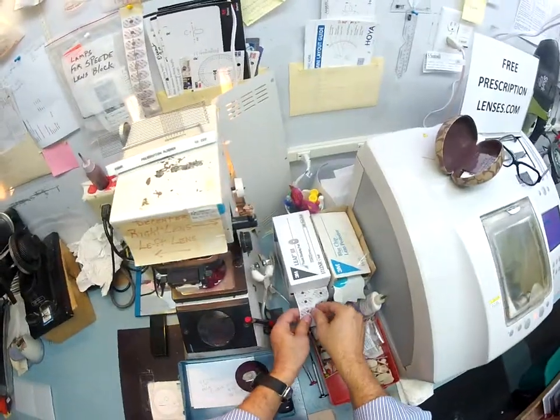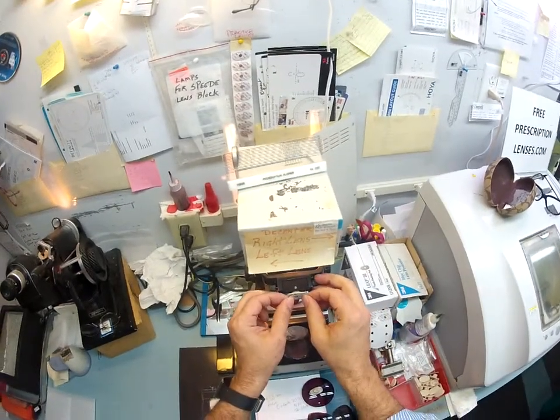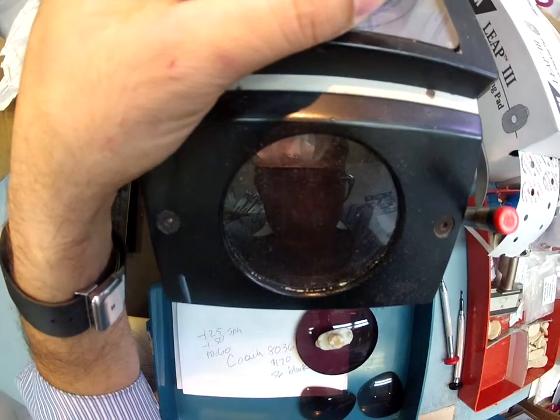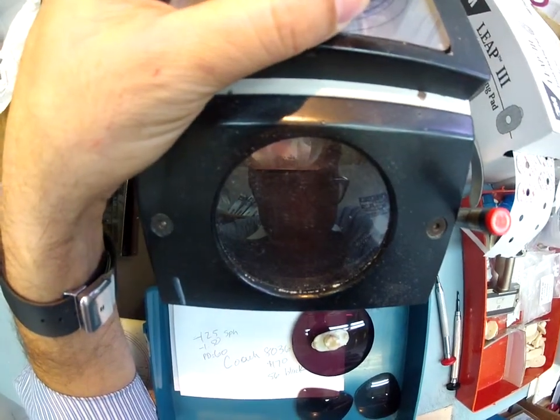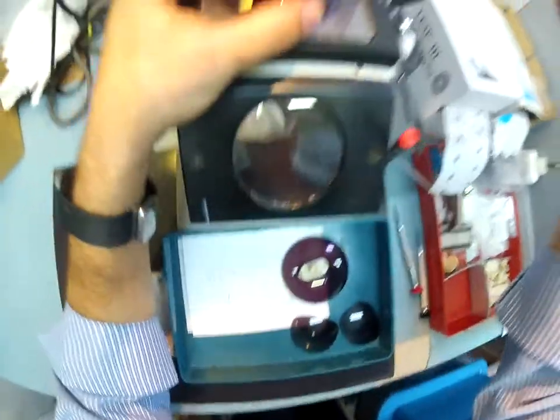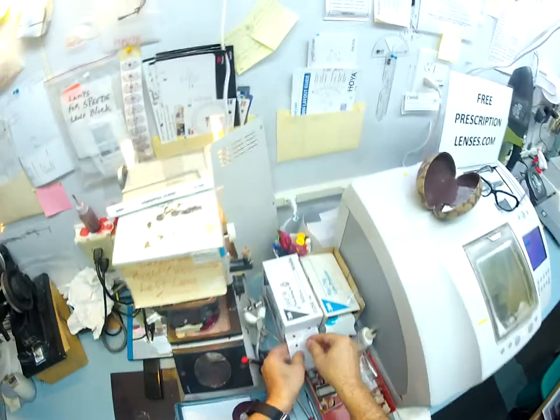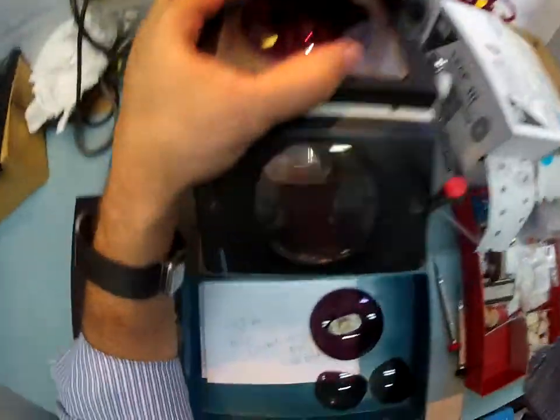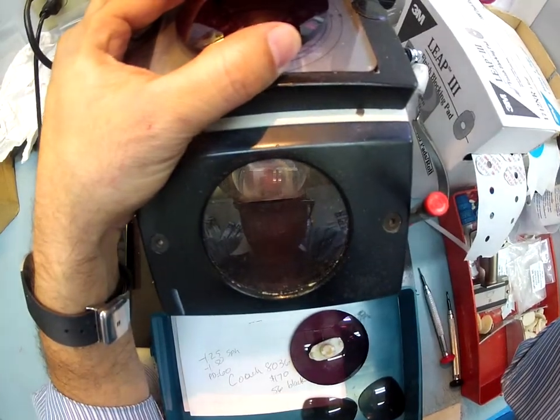And you are getting a solid gray number 3 sunglass lens. So I'm going to move this one to the left 5.5 millimeters. Oops, my camera's in the way. You know what? Got to put a block on there. My camera got in the way. Look at me, I'm getting ahead of myself. Let's put a little sticky pad there. Now, let's move everything over and put a dot on that.